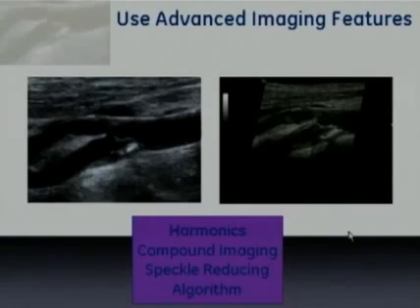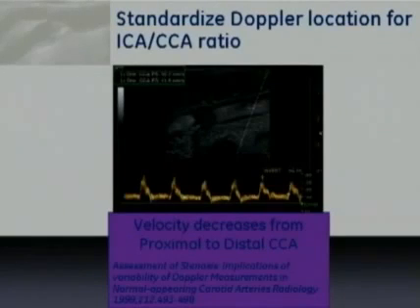So sometimes understanding how to manipulate the controls on your particular ultrasound system can really make a difference in the image quality in certain pathological situations.